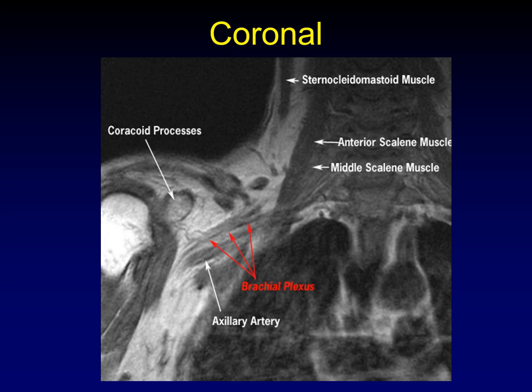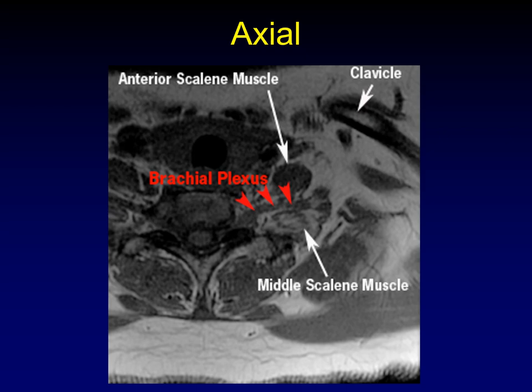Here's the same anatomy in the coronal plane: sternocleidomastoid muscle, anterior and middle scalene muscles, and the brachial plexus coming through the scalene triangle, right above the axillary artery. You can definitely make out the brachial plexus in the coronal plane — it looks like strings of spaghetti flowing through the thoracic outlet. In the axial plane as well, right behind the anterior scalene muscle, you see stringy spaghetti-like elements of the brachial plexus, though the sagittal plane cutting them in cross-section is the preferred approach.